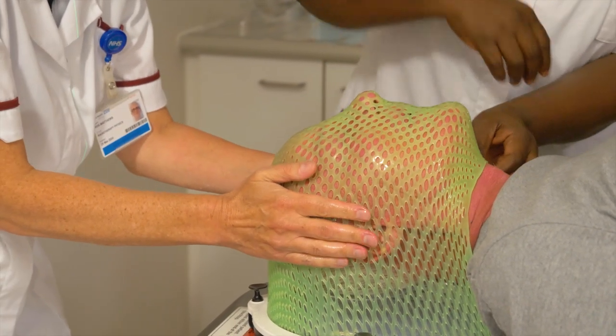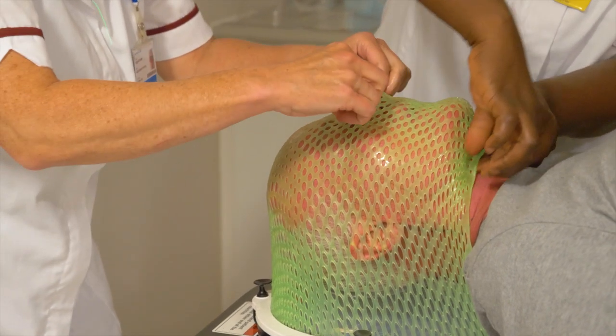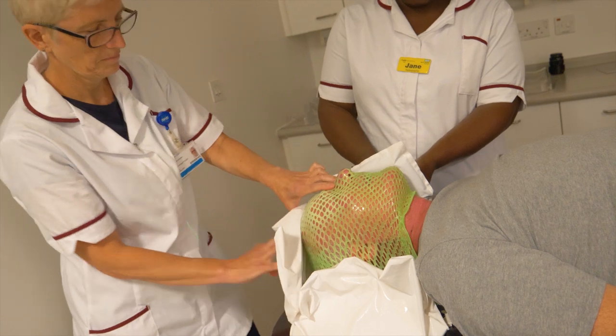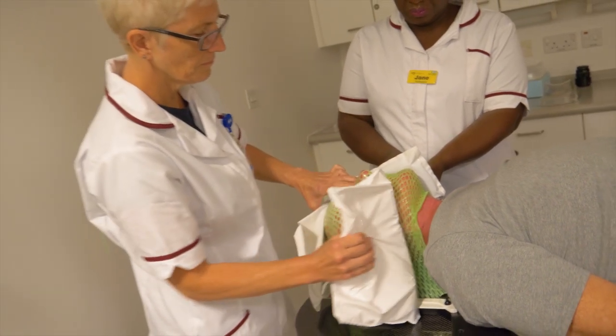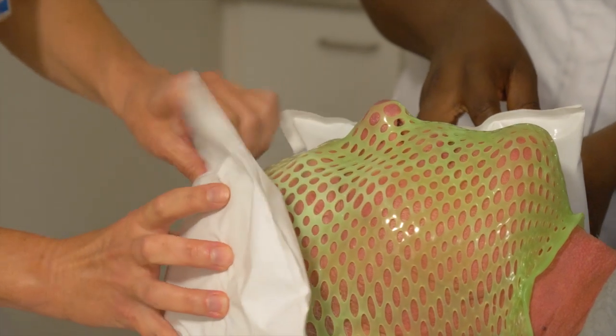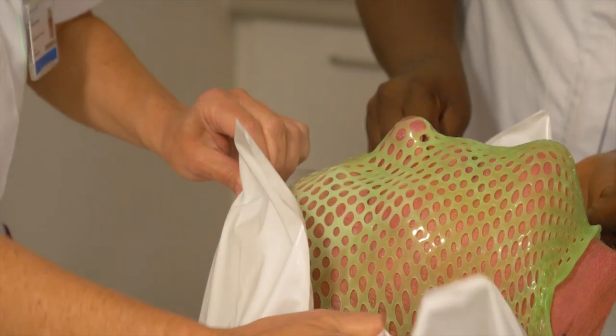The mesh is gently moulded around the face and the sides and the top of the head. As it cools down and as cold packs are applied to the mesh, you can see it turning a slightly lighter colour — becoming more opaque and setting in this position, becoming a lot harder.